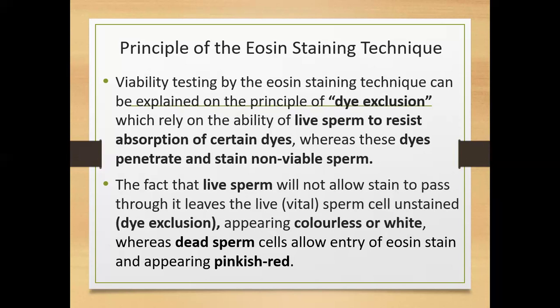I'm talking about the principle of dye exclusion. We are also going to talk about another principle which has a relationship with the same thing. We are explaining the staining on two principles, dye exclusion and membrane integrity, but they work hand in hand. Dye exclusion means it prevents the dye from entering.